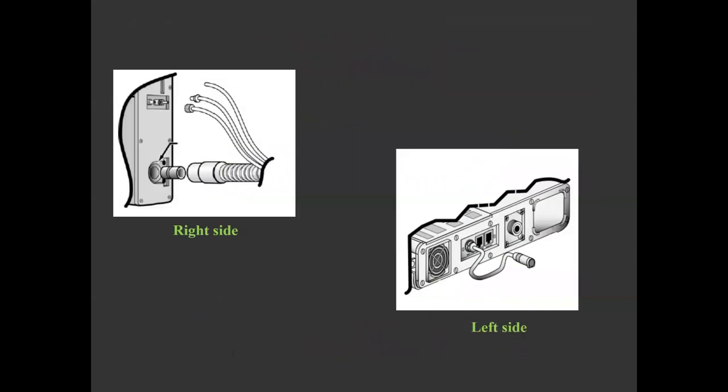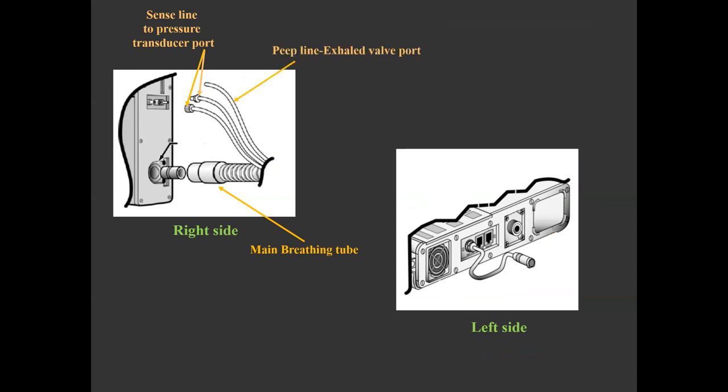Let me show you the ports on the ventilator side. On the right, the main inspiratory limb is connected via a 22mm adapter. The sense lines from the patient Y are connected to the pressure transducer ports that are color-coded yellow and white. The third transparent line is connected to the exhalation port. On the left side, the oxygen inlet port can be connected directly to a high-pressure oxygen source or via an adapter to a low-pressure oxygen source.